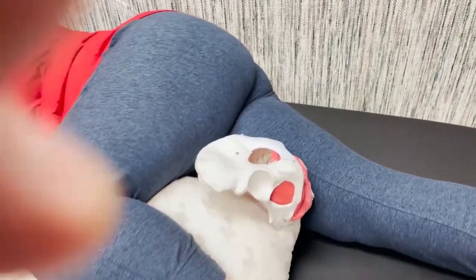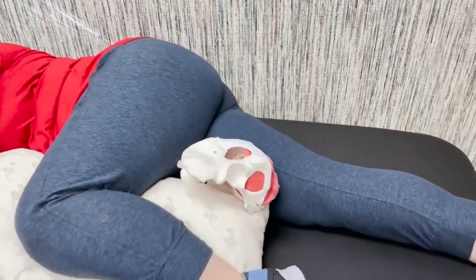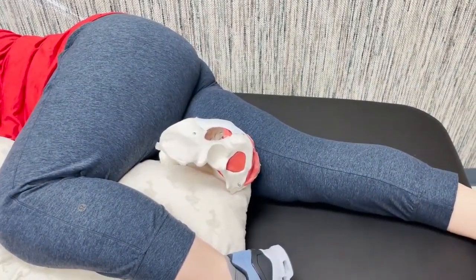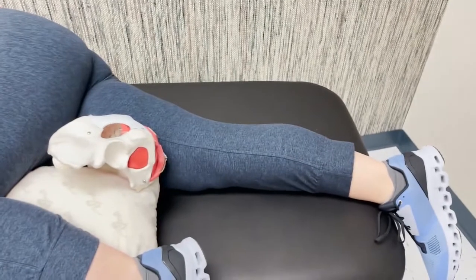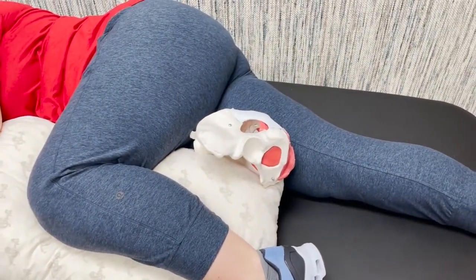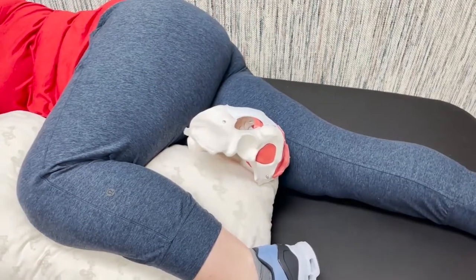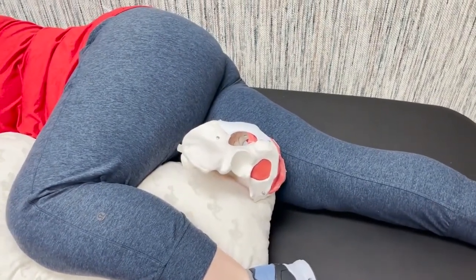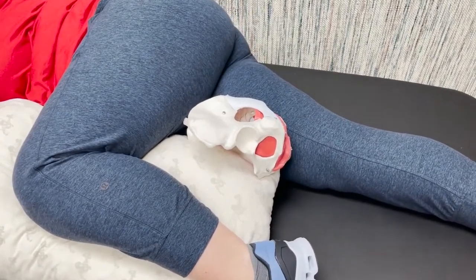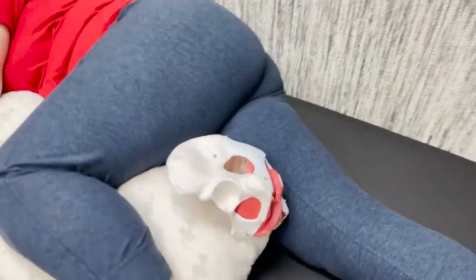For dry needling of the pelvic floor, one of the first issues we want to deal with is that of patient positioning. We frequently, when we think of dry needling the pelvic floor, the first thing that pops into our mind is are we going to place our patient in the gynecological stirrups for treatment? And well, I guess that could be done. Absolutely not the way to do that. We want to stay in the least vulnerable position as possible.